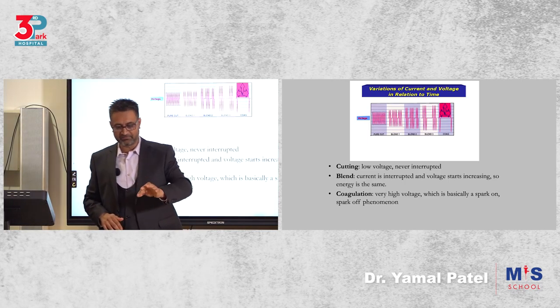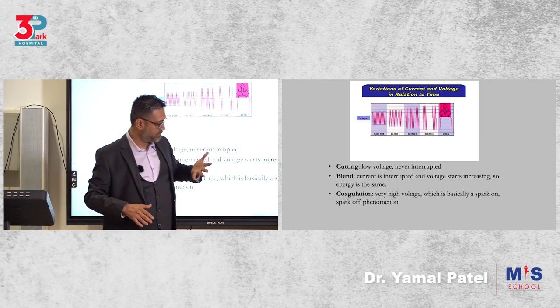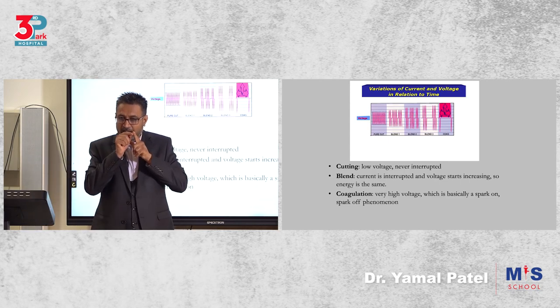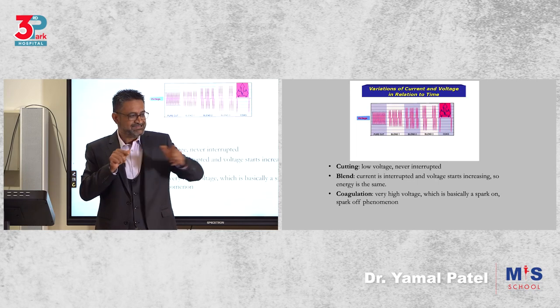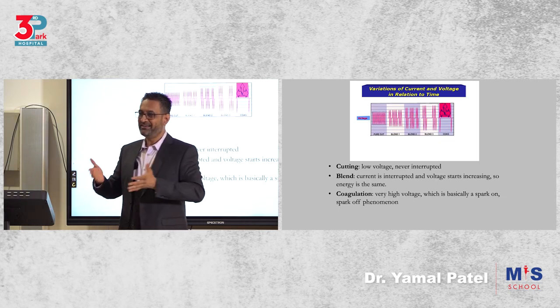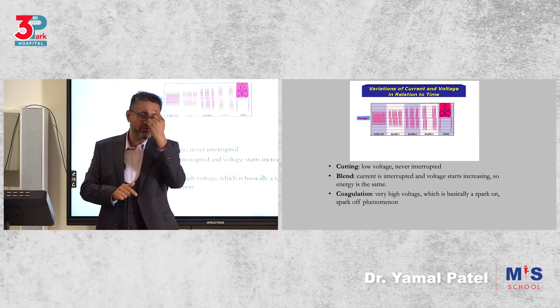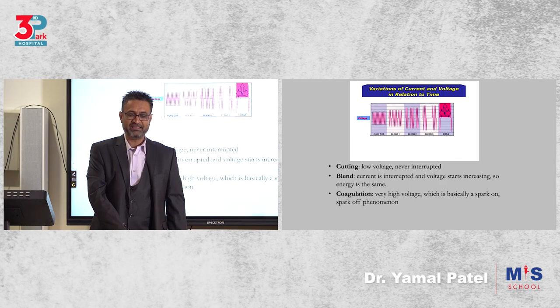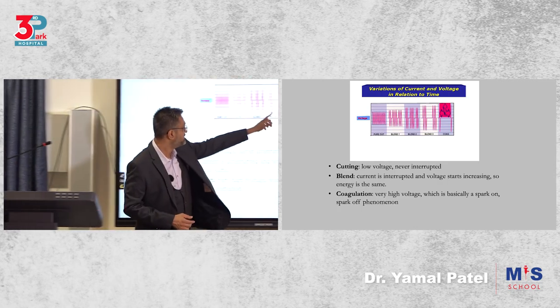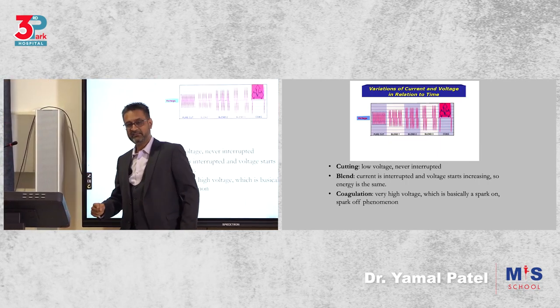When you buzz it with the blue, sometimes you must have seen or heard or experienced it yourself, you suddenly throw your instrument and it will have caused a burn here. You remove your glove and you'll see a small burn. And what is your answer going to be? These low quality Chinese gloves, all right? And the issue was not the low quality Chinese glove. There was no hole in that glove. It found an exit through the glove, through you, out. You've understood what I'm saying? So it's because you used a very high voltage. The high voltage, this end is almost 6,000 volts, and it's like a lightning strike on and off, lightning strike on and off.